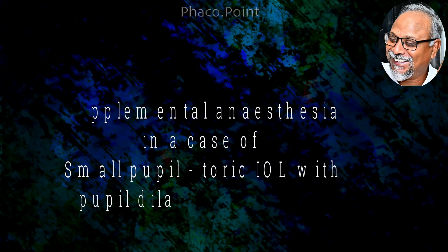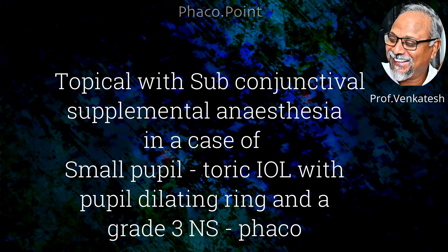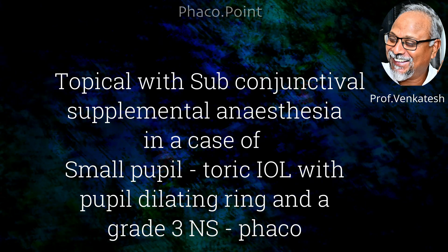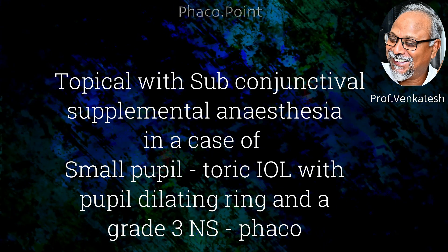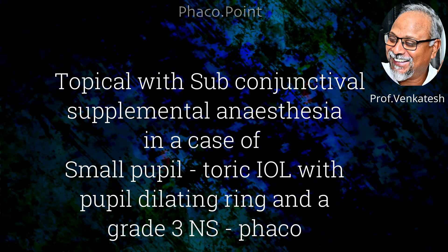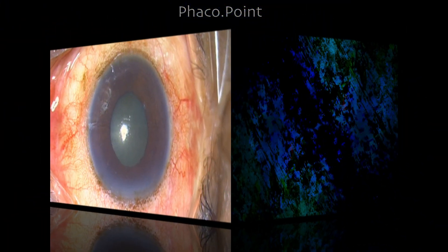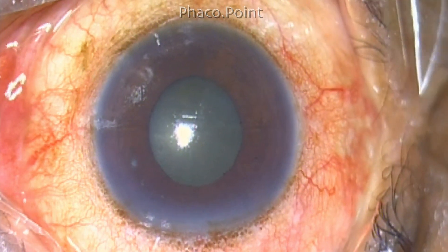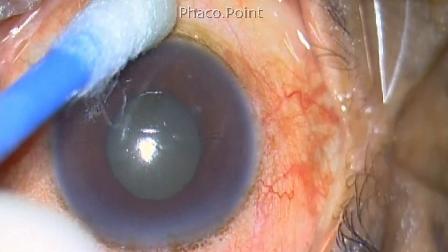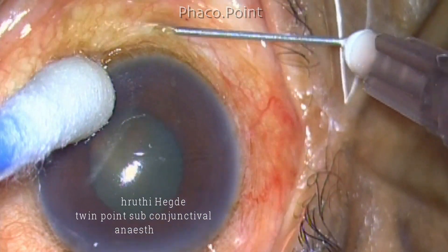This case is about the implantation of a toric IOL in a small pupil using a pupil dilating device in a grade 3 nuclear sclerotic cataract. In such cases I normally tend to block the patient, but I am going to do this case under topical anesthesia with the supplementation of subconjunctival anesthesia. This supplementation works as well as a subtenon block, as described by Dr. Shruti Hegde, my colleague.